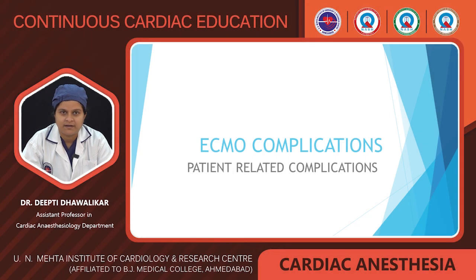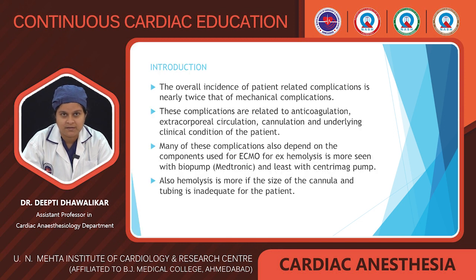Good morning everyone. We are continuing with the ECMO series and today is the second lecture on ECMO complications. We are going to focus on patient related complications today. The overall incidence of patient related complications is nearly twice that of mechanical complications. These complications are related to anticoagulation, extracorporeal circulation, cannulation and the underlying clinical condition of the patient.